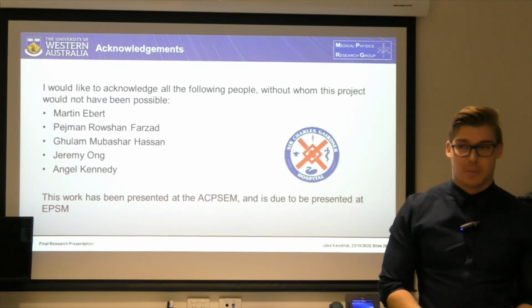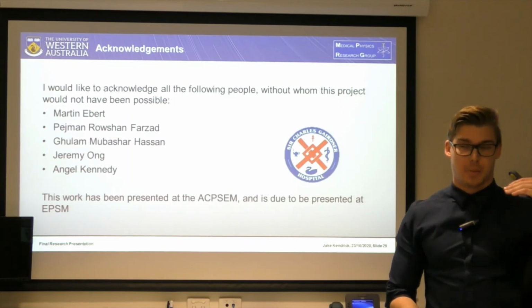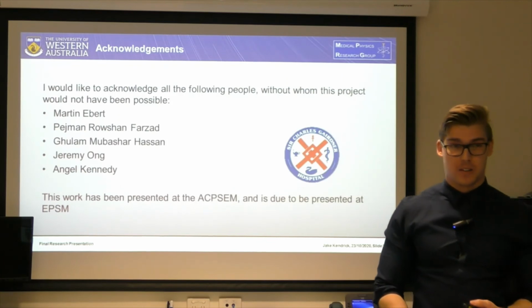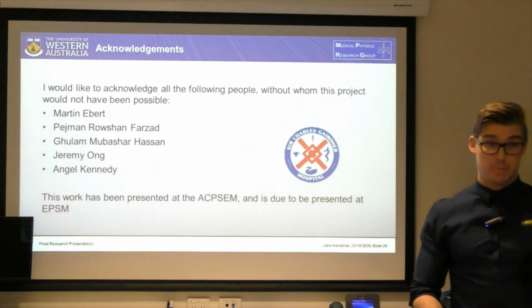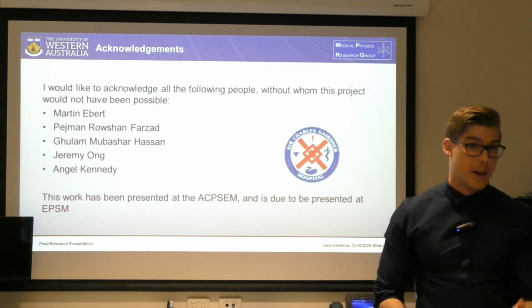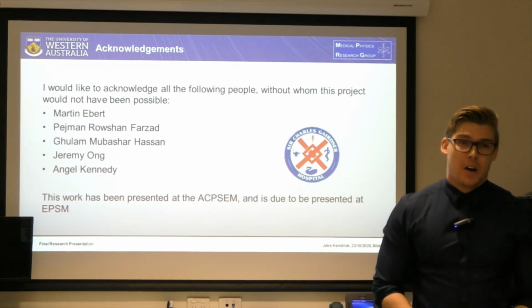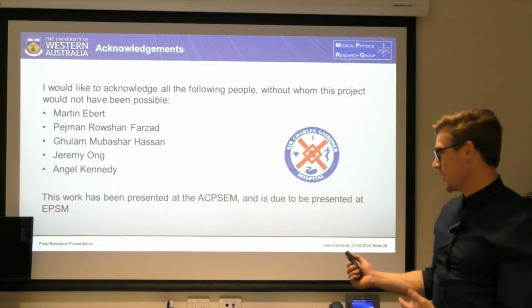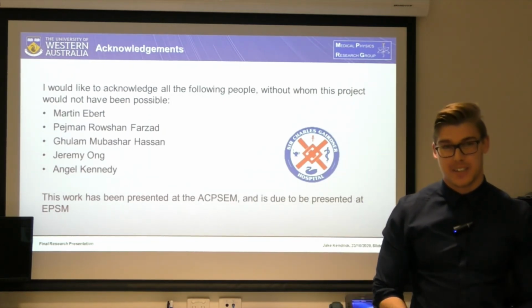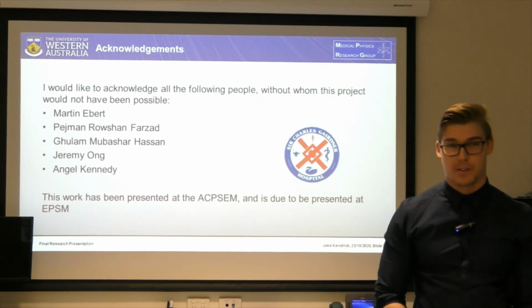But during the manual segmentation process, Jeremy utilizes a semi-automated method. So he applies a threshold of 3 standard uptake values, which, to follow on from Martin's question, I think would be a good thing to mimic as well, just to get rid of some of that useless information. But yeah, focusing on just the PET images would probably be a good way to go. Although, like I mentioned, the current literature results suggest that it's super additive to also use the patient's CT images. That wasn't corroborated here, but perhaps it's worth experimenting further with that.